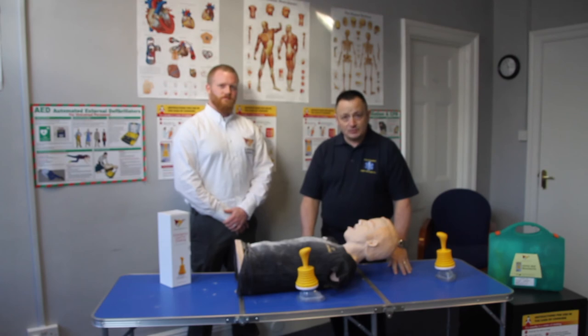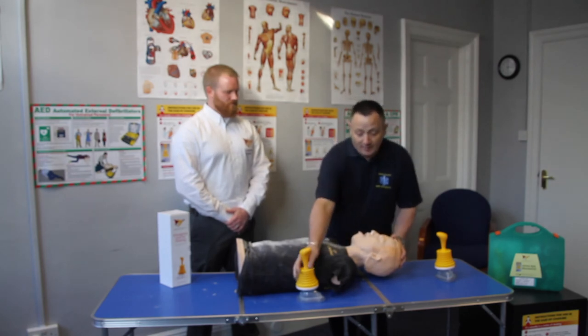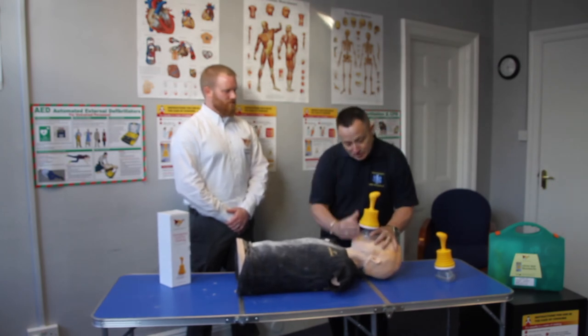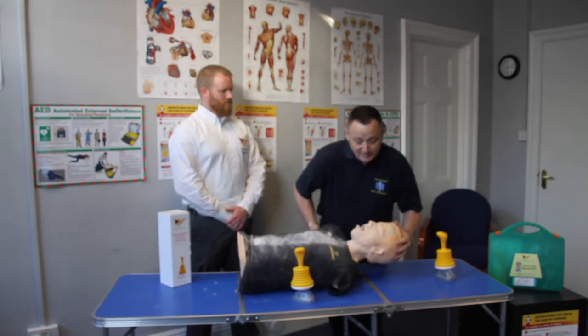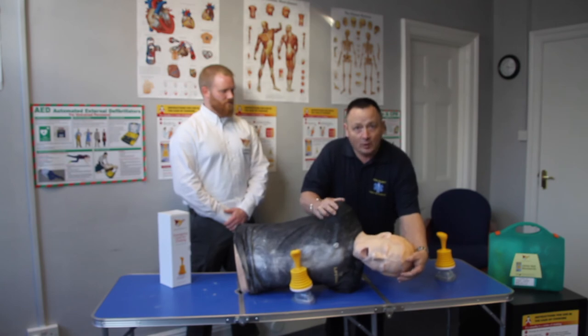During the presentation, we saw some key points being made: a slight head tilt chin lift to make sure we have a good patent airway. When we applied the LIFEVAC, we came across and down to the bridge of the nose and ensured a good seal. When we push down and pull up, making that vacuum, it helps to release the blockage. If you know the blockage has been released but hasn't come completely out, turn them over to make sure the oral cavity is clear and release the blockage.